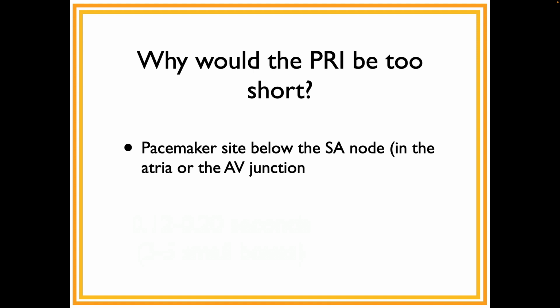In kids and young adults, a lot of times the pacemaker will wander around the atria and it doesn't mean anything, and you wouldn't feel it. It would be very unlikely to be a congenital problem. It's probably some outside influence, inside influence. So that's one reason for a shortened PR interval.